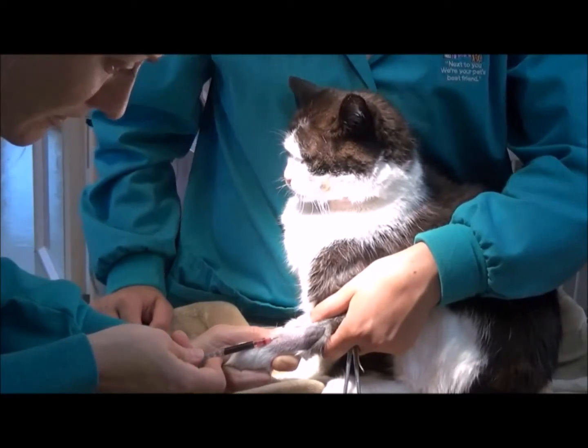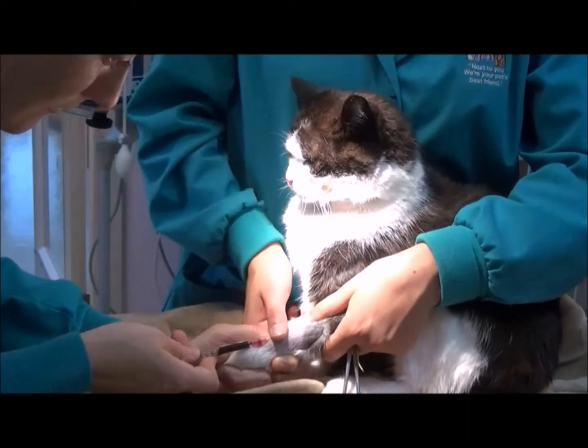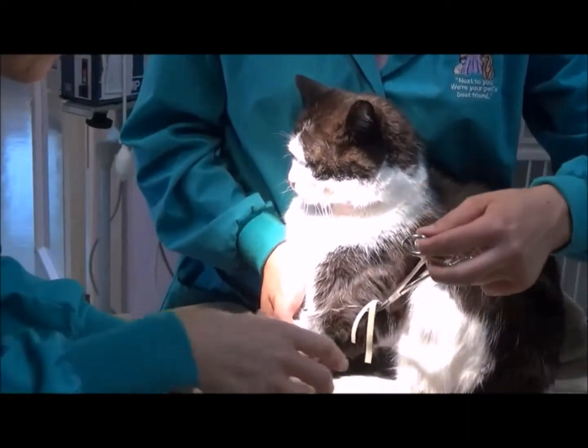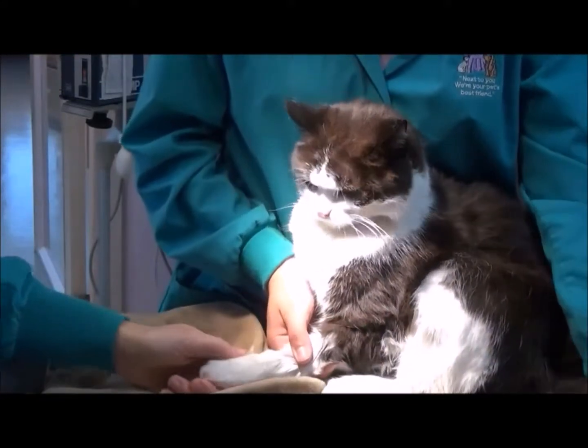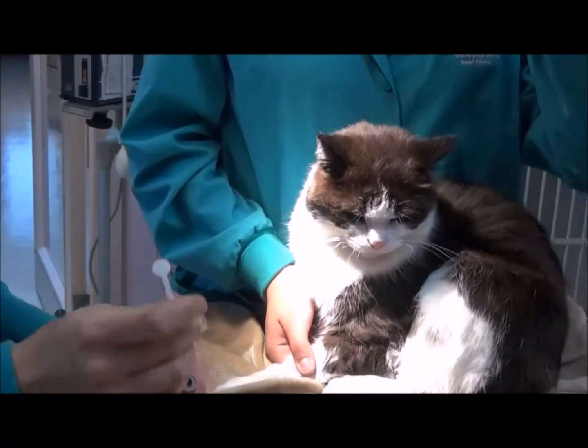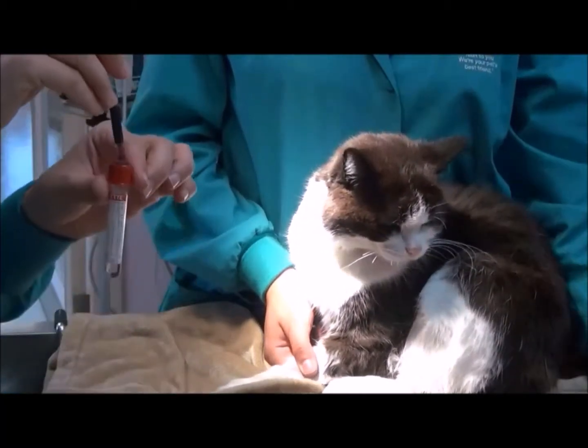Okay, and that's plenty enough. So I'll have you put your thumb over that. Perfect. Take the tourniquet off. Perfect. And then we'll just put our blood in a blood collection tube.